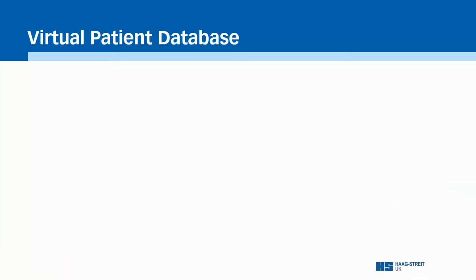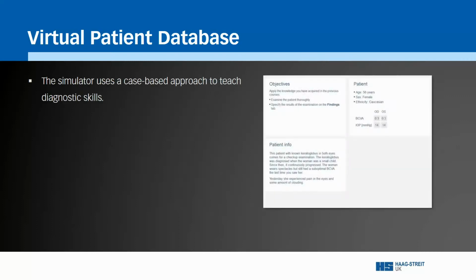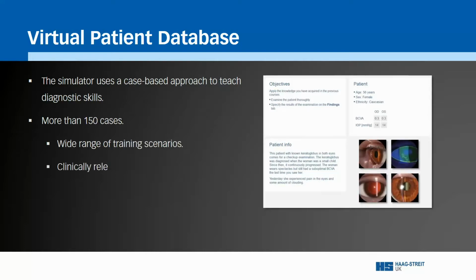The Virtual Patient Database. As well as training users to control the device, each Eyesi simulator utilises a case-based approach to teach diagnostic skills, something that's difficult to teach in a busy clinic setting or practicing on colleagues. Each case includes clear objectives and detailed patient information. The Eyesi Slit Lamp simulator includes more than 150 onboard cases, covering a wide range of different training scenarios, featuring highly realistic, clinically relevant pathologies and lesions.